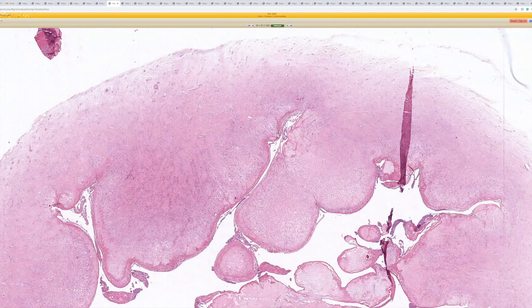I think that the clinical does make a difference there and there certainly can be a lot of overlap. This is labeled as ganglion cyst. A lot of times when I see a ganglion cyst it's just dense collagen, dense regular connective tissue lining with no actual lining cells, so it's really a pseudocyst. Although occasionally you can have some synovial lining in it, they may be filled with kind of bluish mucin, myxoid material which is basically synovial fluid.